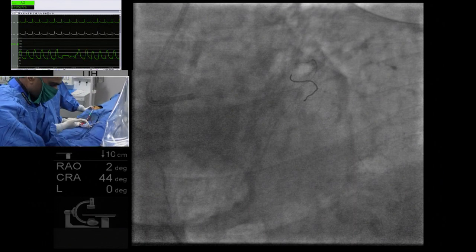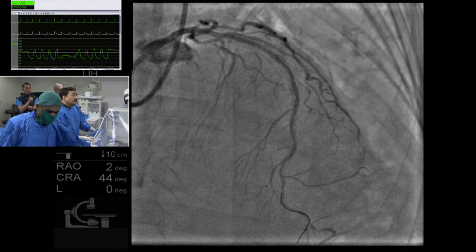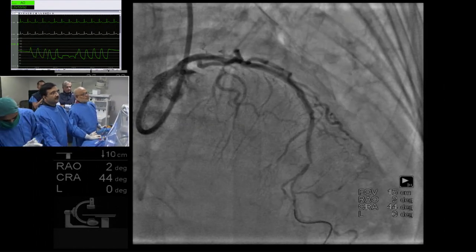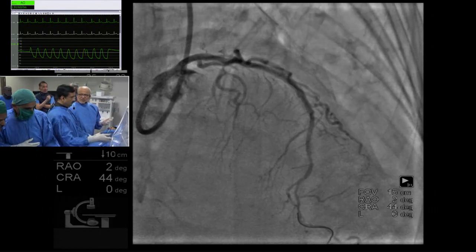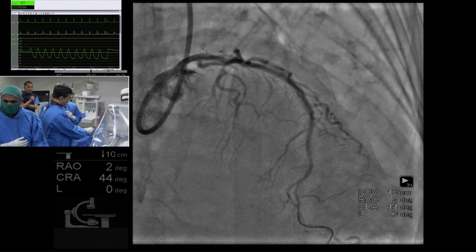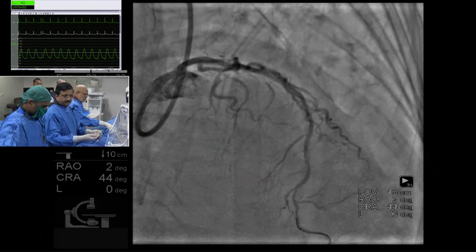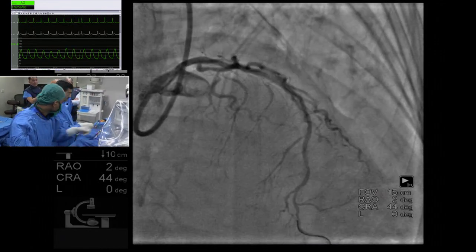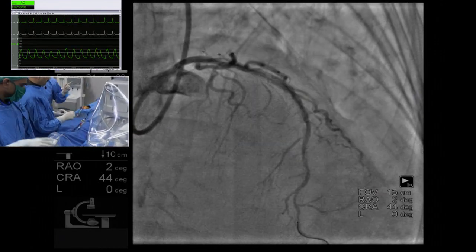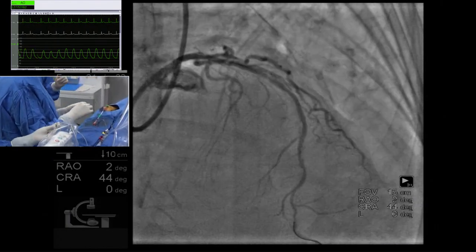So Mauricio, there's a study for IVL for aortic stenosis. Have you heard about that? For valvuloplasty, you mean, right? Yes, correct. Tak, I will request you to go and scrub in that lab, because now I do one OCT run, stent, and another OCT run. So I will be done within 5 or 10 minutes, hopefully.